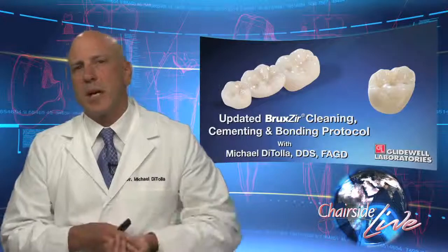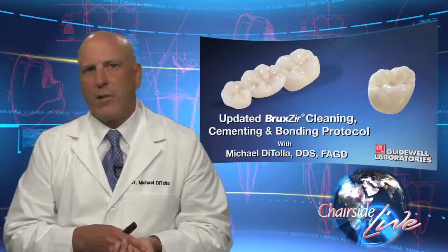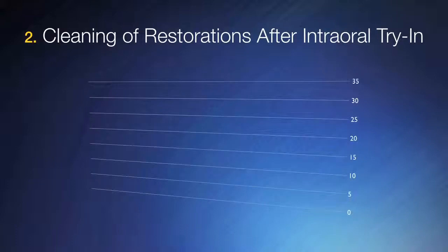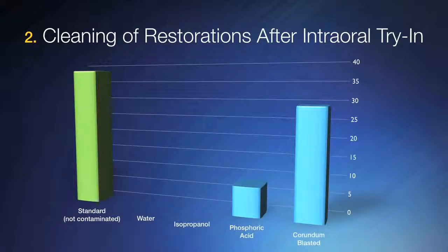Well, there was a study done in 2008 and published in the Journal of Dental Materials. Let's take a look at what they did. They took zirconia-based crowns and treated them in 4 different ways. They bonded a crown that had not been tried in the mouth yet. They took another crown and tried it in the mouth, then rinsed it with water for 15 seconds and air dried it.